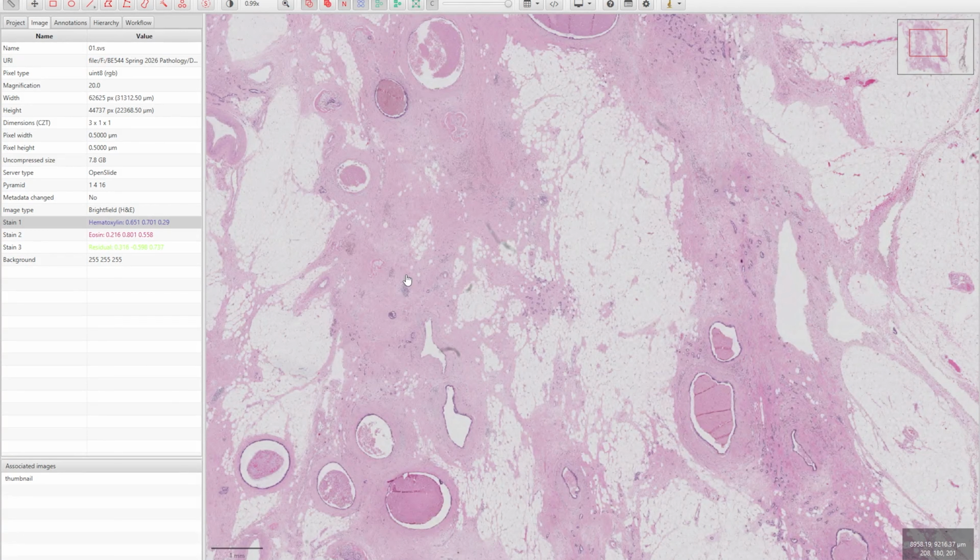So for example, we can extract different regions regarding normal cells, other regions for tumor, and build a machine learning model that can classify between the normal and the tumor. Also, you can make it multi-class classification by selecting some regions for normal, some regions for tumor, let's say benign, and others for malignant tumor, or other grades of the tumor depending on the dataset you are selecting, and build a multi-class classification pipeline and model to classify later between the different categories.